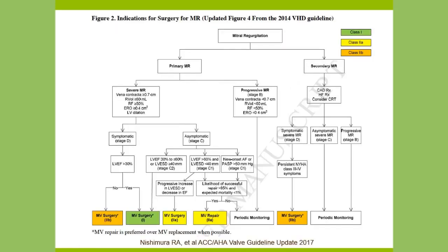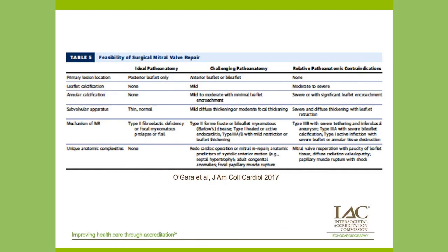So again, the guidelines on mitral regurgitation divided into primary and secondary MR, and primary MR goes down this pathway generally towards surgical repair, whereas secondary MR has a different pathway and surgery is not as clear cut. So it's important for us doing an echo to decide, is this primary or is this secondary? What is the exact mechanism of MR? Is it repairable? Does it have to be a replacement? All of this is super important for us to get right.